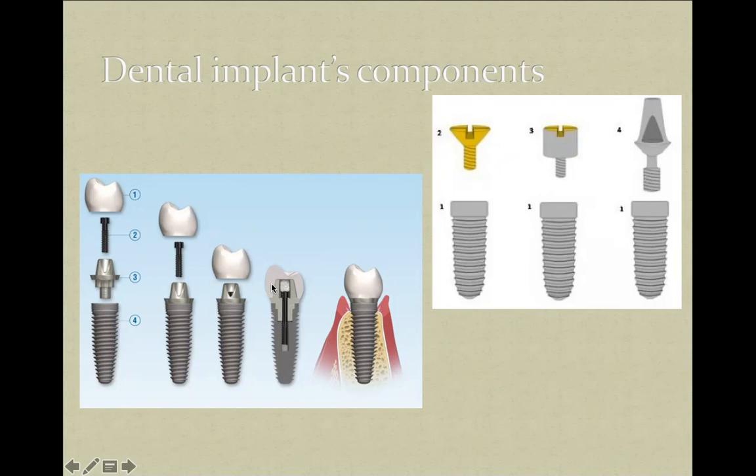So the abutment will be fixed mechanically into the dental implant by means of the screw. And thereafter, you can place your crown restoration that might be metallic ceramic, zirconium, or a pressed ceramic restoration. It's up to you.